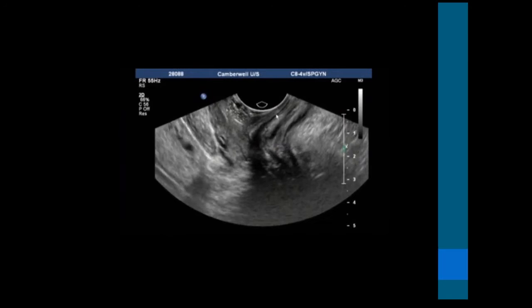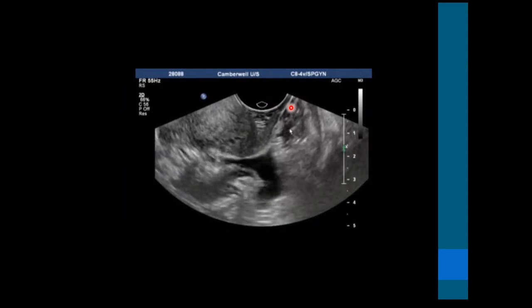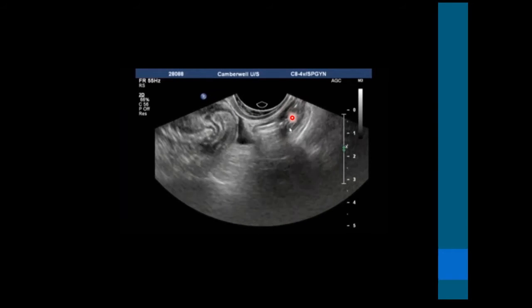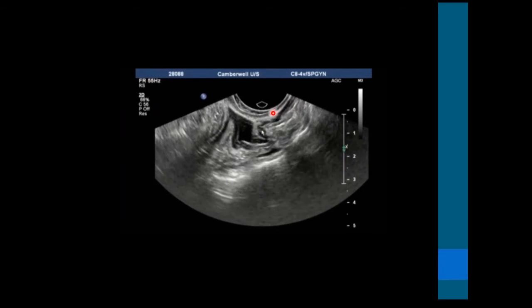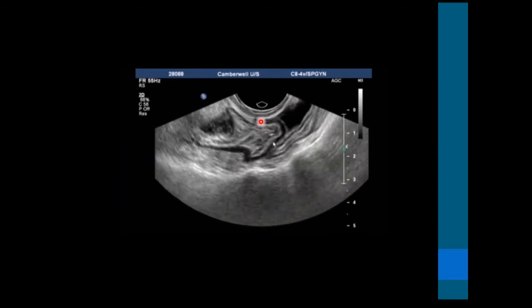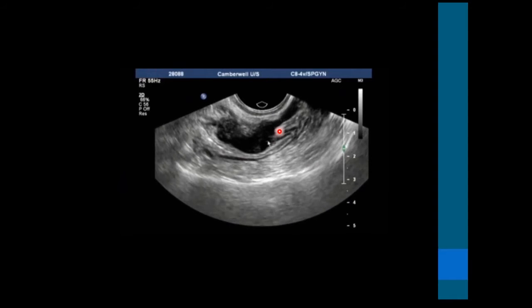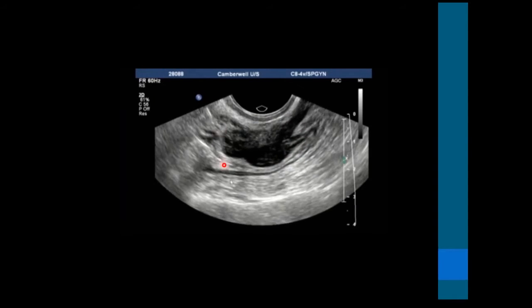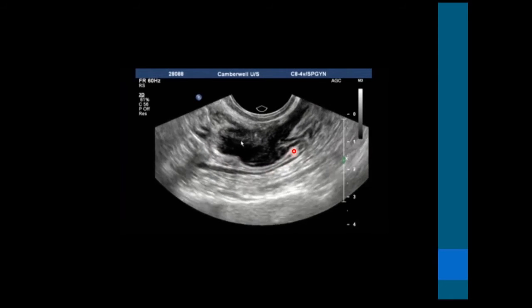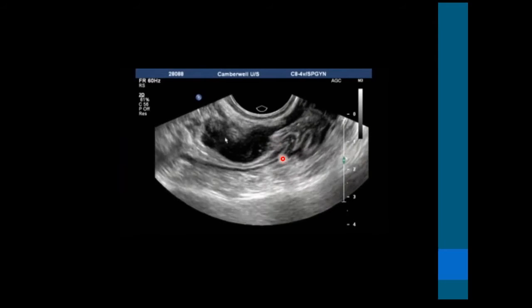And so again, here with the arrow, I'm showing the patient in this clip. So basically, following the muscularis, continuing to follow the muscularis. A little bit more difficult because there is a little bit more gas in the bowel, but when you try, you can still see the bowel quite well, and you follow it, and then you start seeing something coming into view here, and it's very obvious. Suddenly there is this big lesion on the muscle layer of the bowel, and you can see the submucosa overlying this, the white layer, and you can see how it goes through the submucosa here, because there are these black lines going into the submucosa.